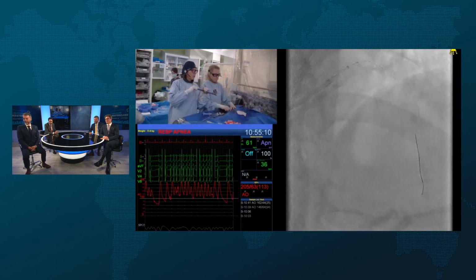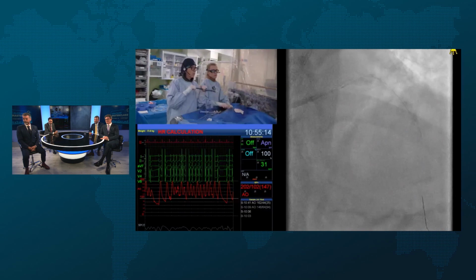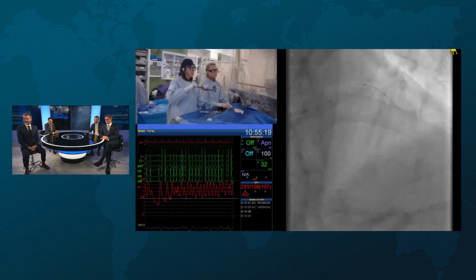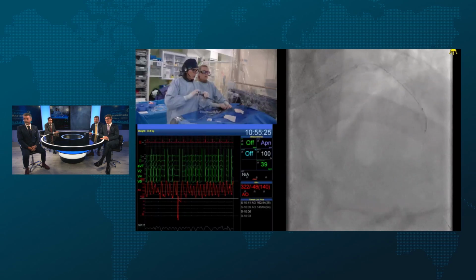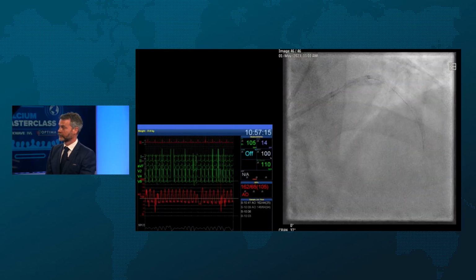What's your wire? These kinds of cases, they have to say that just on repeat. Nice. Very nice work. Okay, good. Well done. Beautiful. Okay, we're gonna go there. This is an NC, is it? A 3-0. Okay.